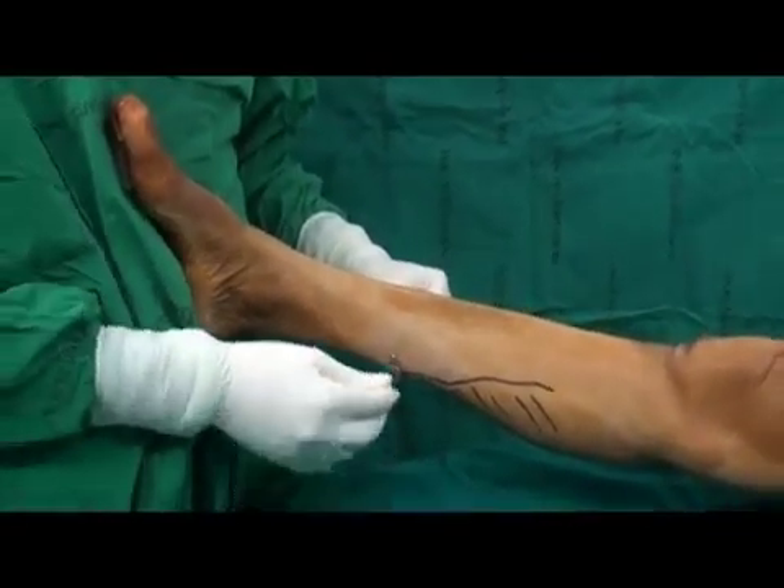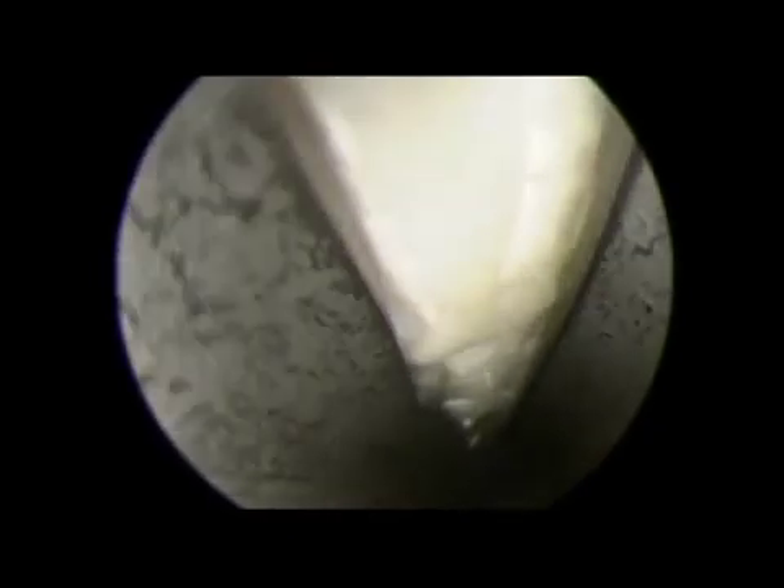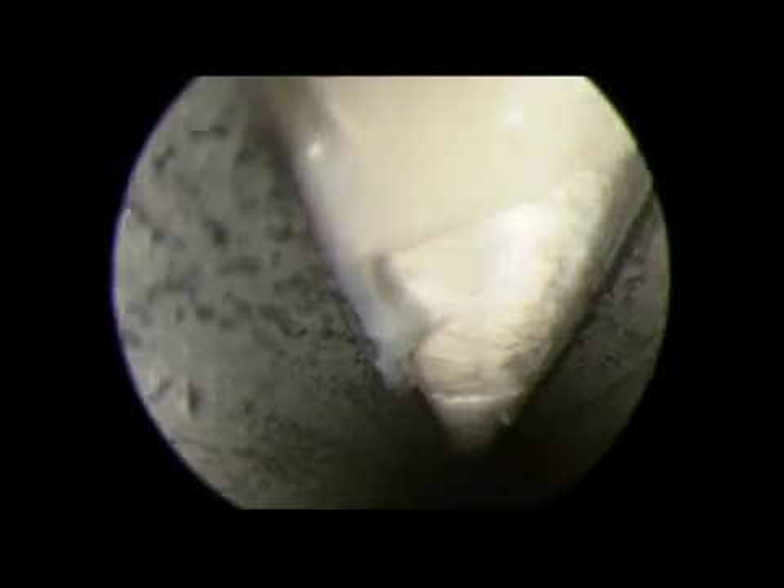A blunt Q-tip is used to clean the blood. A camera is introduced from the medial portal. The gastrocnemius fascia is then demonstrated from medial to lateral direction, and can be further observed by moving the ankle up and down.